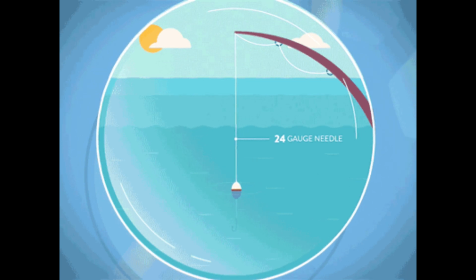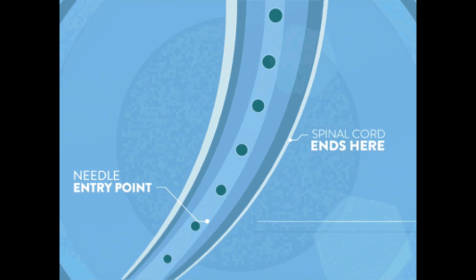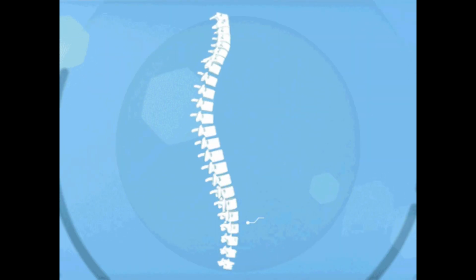Sometimes a lumbar puncture is used to inject anesthetic medicine or chemotherapy into cerebrospinal fluid. Why is it done? A lumbar puncture, also known as spinal tap, may be done to collect CSF to check for infection, inflammation, or other disease.